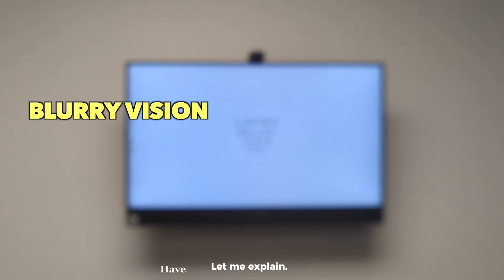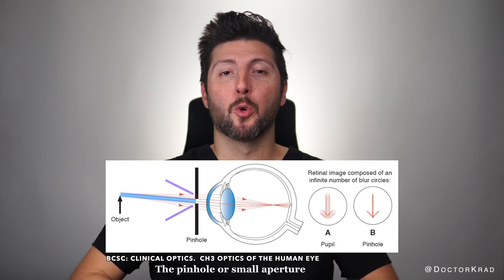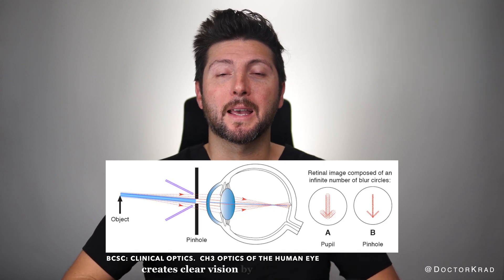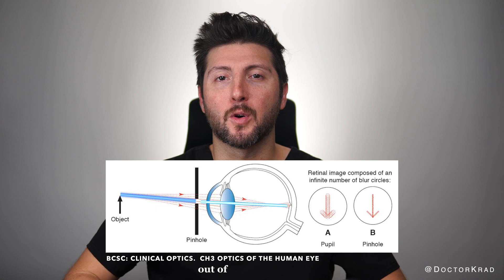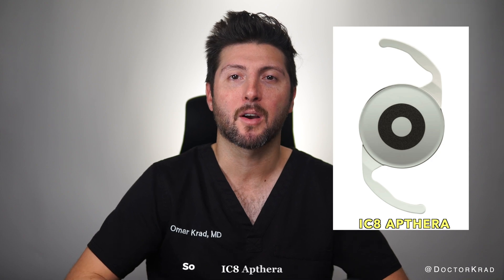Let me explain. Have you ever been to the eye doctor and they have you look through a pinhole and it makes everything clear? It's like magic. The pinhole or small aperture opening creates clearer vision by eliminating scattered out-of-focus light rays. That's the idea behind the presbyopia-correcting lens IC8 Apthera, or AcuFocus.